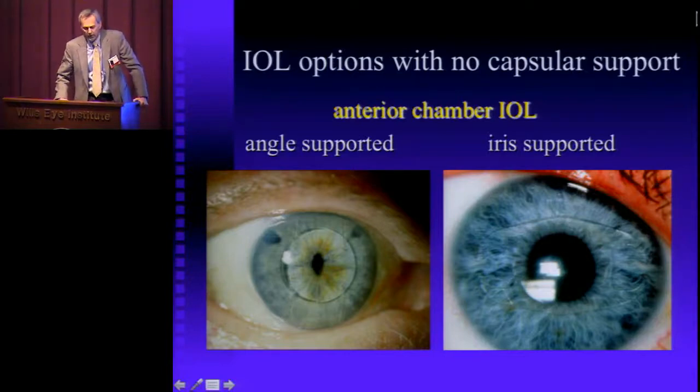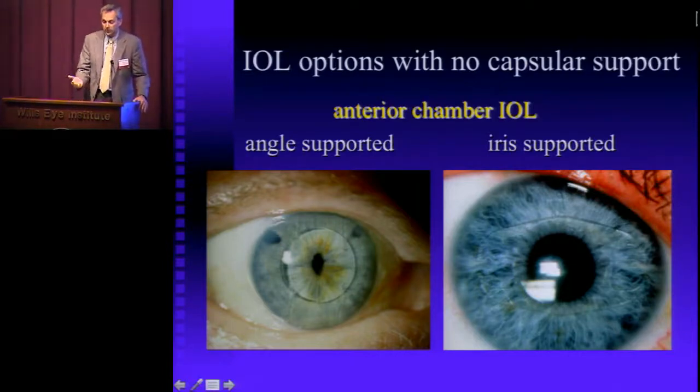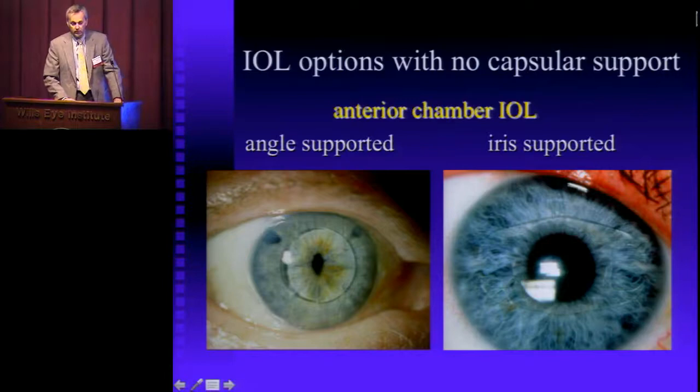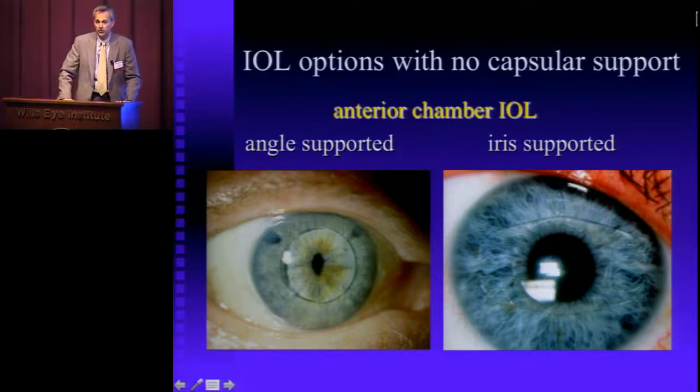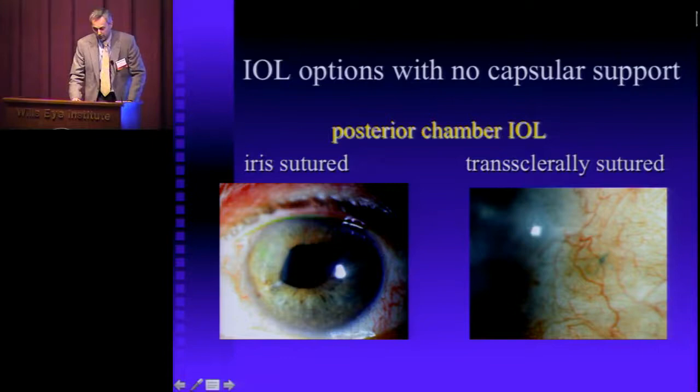An anterior chamber lens is probably the best way to go for a dislocated posterior chamber lens. And anterior chamber lenses got a bad rap early on, but many anterior chamber lenses, such as these early types, a Leitz lens and a Choyce lens, have done very well and served patients for years with good vision. Now, we know about the UGH syndrome and all the problems that come with anterior chamber lenses. I'll discuss those in just a minute.